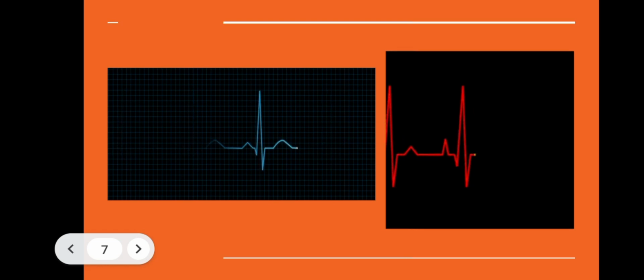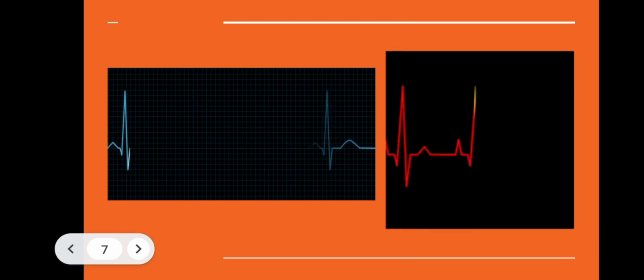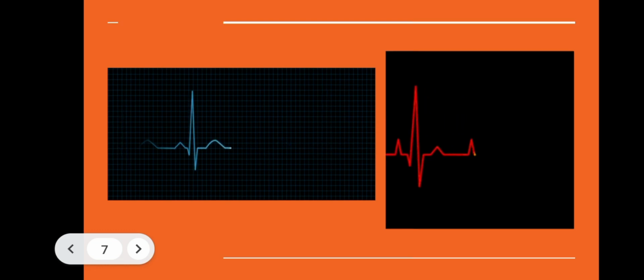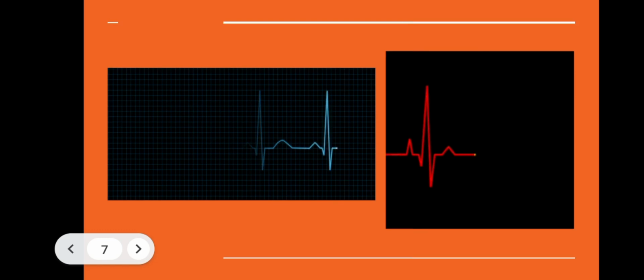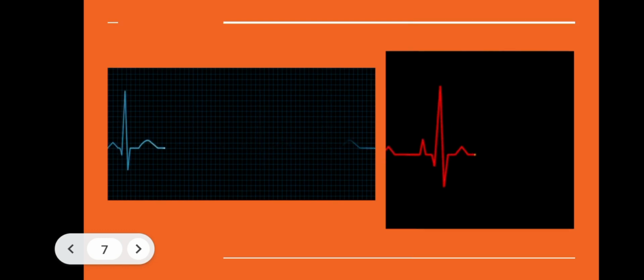Let's have a quick recap. For your P wave, atria contract, of course, that's around 0.1 second. For your PR, atria going to your ventricles, that's less than 0.20 seconds.